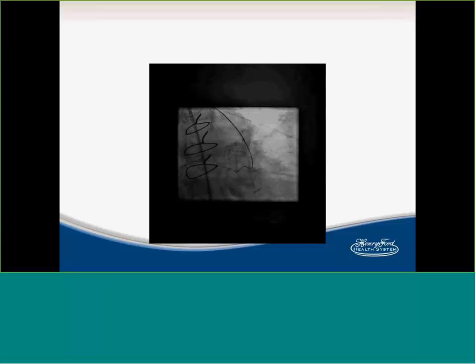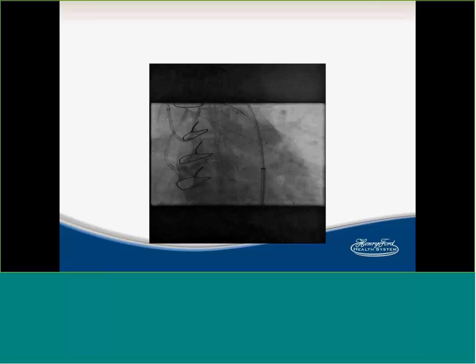That's a good one. So you tried all the balloons, it didn't work. You tried GuideLiner or any anchor or any support. You did the reverse anchor on the graft. It didn't work either. And then you said that you don't have a Threader, the Glider. You tried a bunch of balloons. You broke them. Didn't work. I guess the next step, again, laser. You don't have a laser. Rotablator. You don't have a Rotablator.